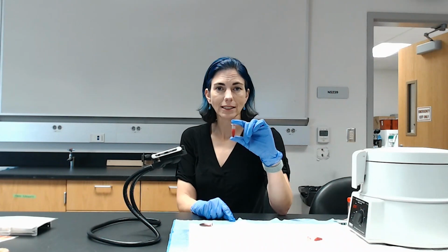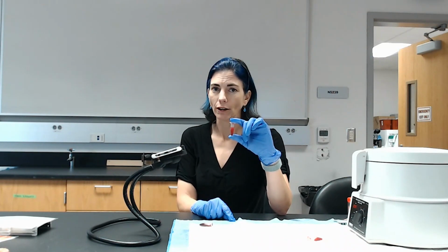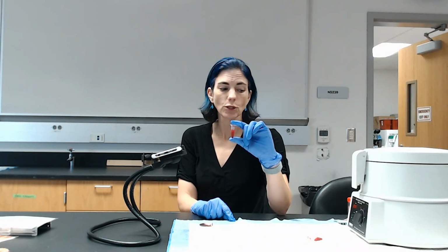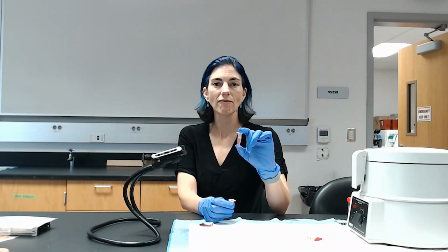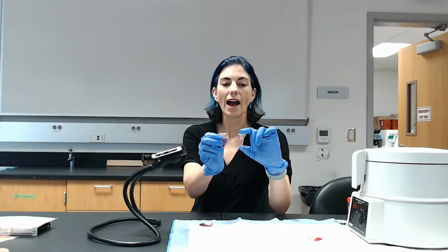So for the red blood cells, what we're going to do is we're first going to do a 1 in 200 dilution. There are far, far, far too many red blood cells in this drop, even a microliter, to count on a slide. So instead we're going to do a 1 in 200 dilution where I take saline solution that has 995 microliters in it, and I take 5 microliters from this and put it in there. And then I have my diluted sample. You can see that's much more dilute.